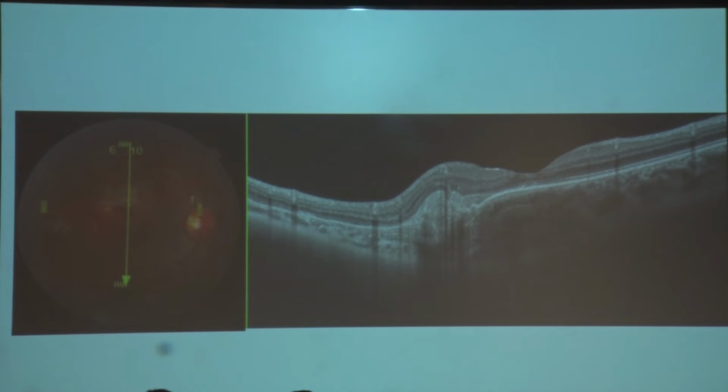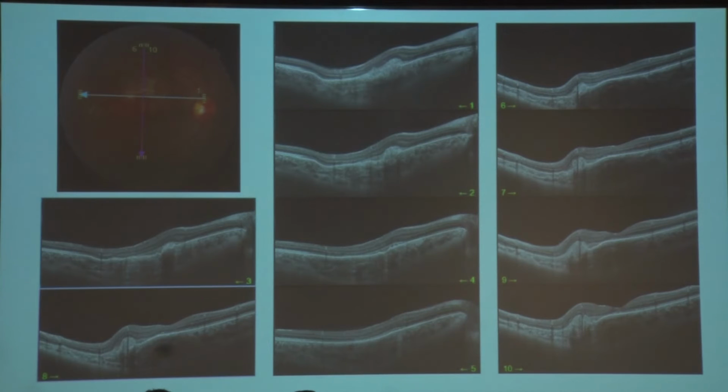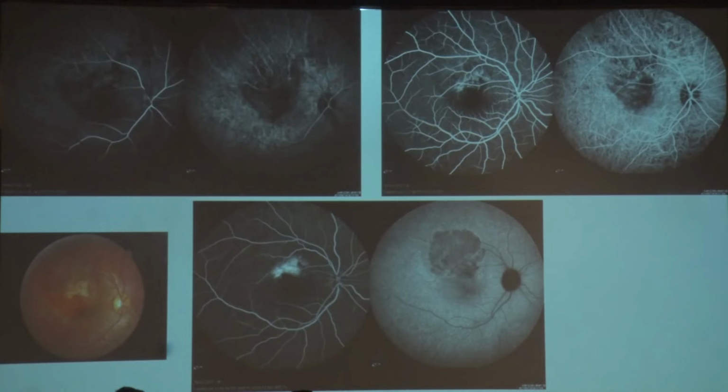These are offset scans. But the choroid beneath was not normal. As we go along the scans, we see that a large area is being encompassed by this entire complex, the membrane complex and the other structure. So on performing an angiogram, what we found was hypofluorescence in the early phases, then a membrane complex appearing, and a patchy hyperfluorescence later on.